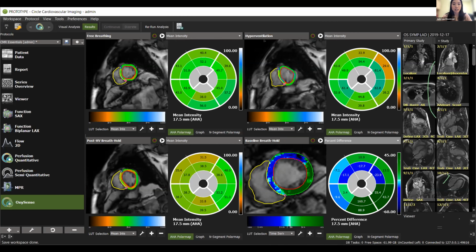So on all cardiac MRI scans, obviously if they're a critical patient, any difficulty being supine is probably making it difficult. But it's not just for the OS CMR scan, it's for the entire cardiac MRI scan overall. That's a very minor limitation of cardiac MRI overall, because the patient does have to lay supine for some time. And I do reiterate that if they do have fluid in their lungs, it will be difficult overall.